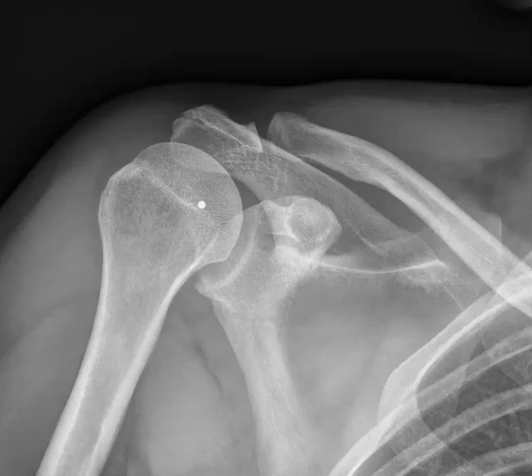Hello, this is Dr. Gay from FirstSec MRI, and this is a short video to show how we do an arthrogram of the right shoulder prior to an MRI scan.